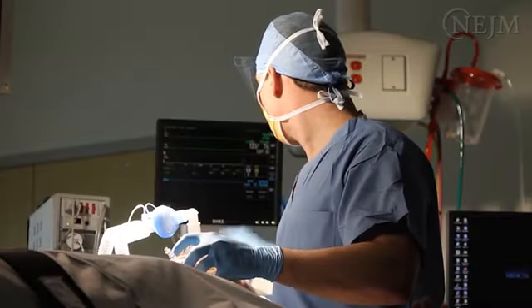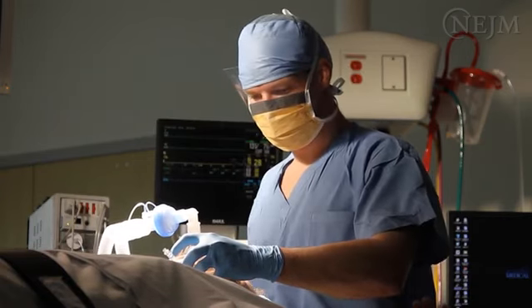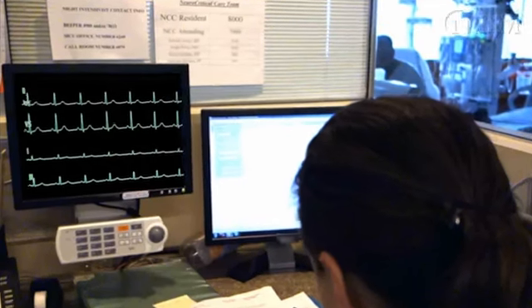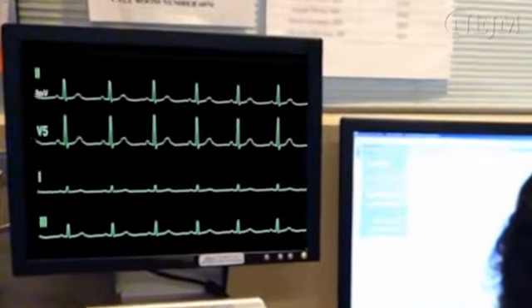ECG monitoring is useful, simple, and widely used in hospital-based care and in many other clinical settings. Clinicians must be familiar with proper use of this monitoring tool and know how to interpret the information it provides.